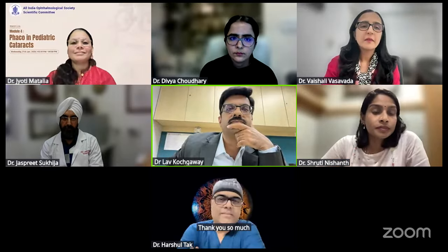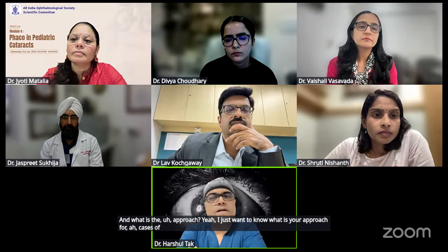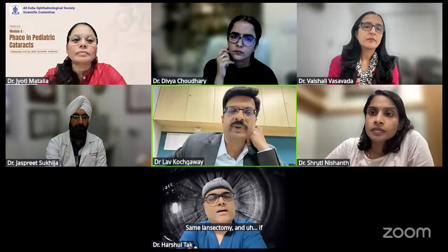And what is your approach for cases of microspherophakia, Dr. Jyoti? Same lensectomy, and if the size is permitting, then put a scleral fixated lens. But especially these have to be older children, not a very young child. My criterion is generally 8 years and above, if I'm doing a scleral fixation.